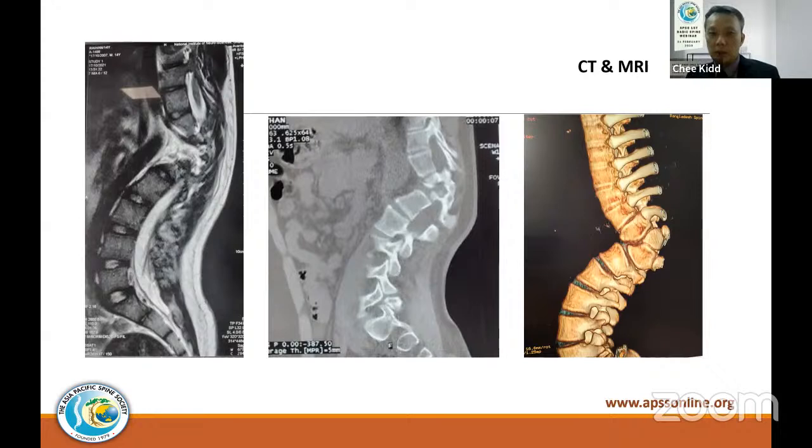Yeah, so very good afternoon. Actually, this is similar to the severe kyphosis in tuberculosis, which we get in Asian countries. So the steps are the same as Professor Gabriel has rightly mentioned. You have 3 levels above anchor and 3 levels below anchor, and one has to do the posterior VCR. And you have to have a very controlled correction. Usually we put the posterior shortening and anterior controlled distraction, and then you get a good correction.